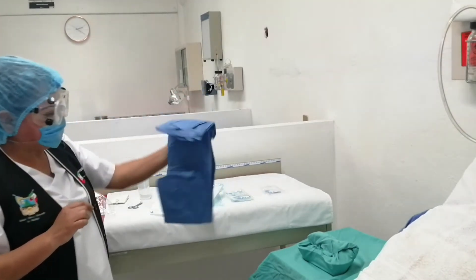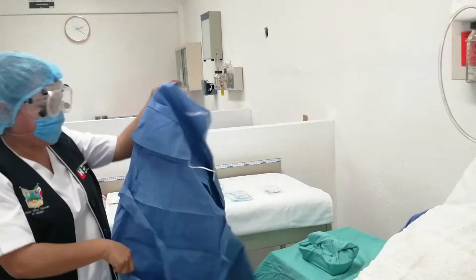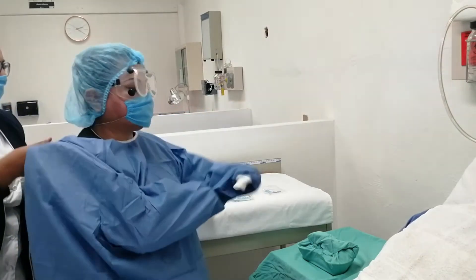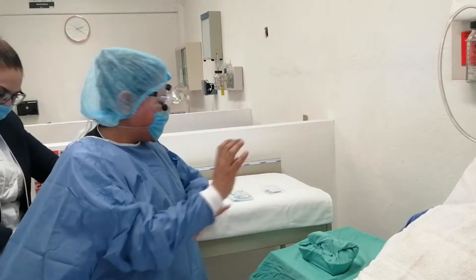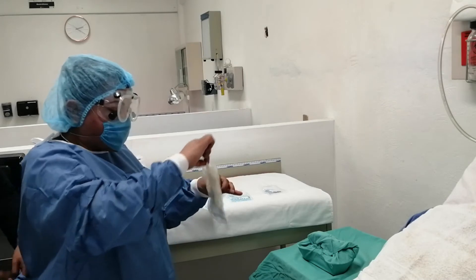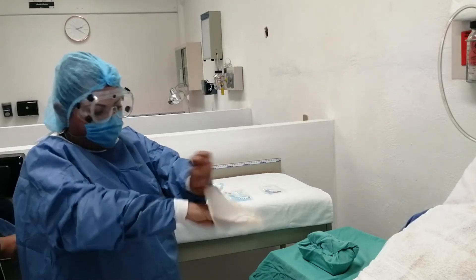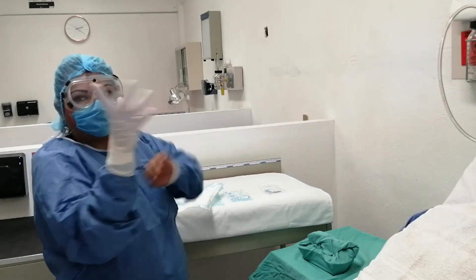Proseguimos a colocarnos la bata. Si hay una compañera, le pedimos que la ajuste. Podemos sacar las manos porque el guante va a estar estéril. Procedemos a tomar los guantes desechables, que son ambidiestros. Al colocarnos los guantes, podemos tocar por dentro todo lo que queramos, pero por fuera nada. Metemos la mano por dentro y ajustamos perfectamente.